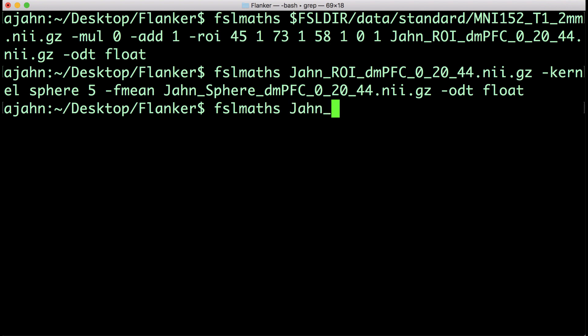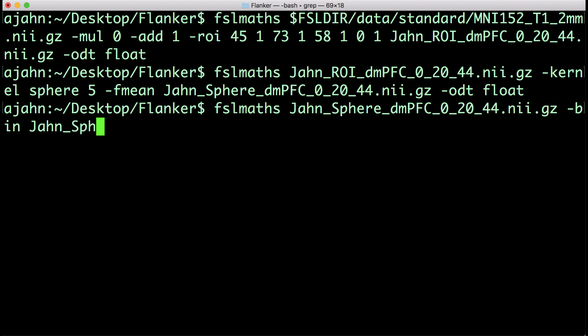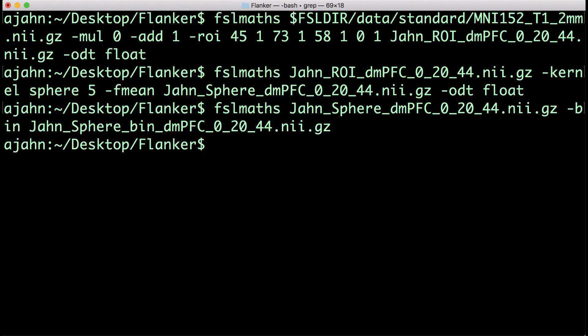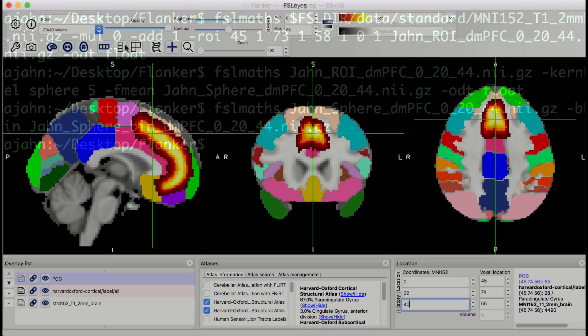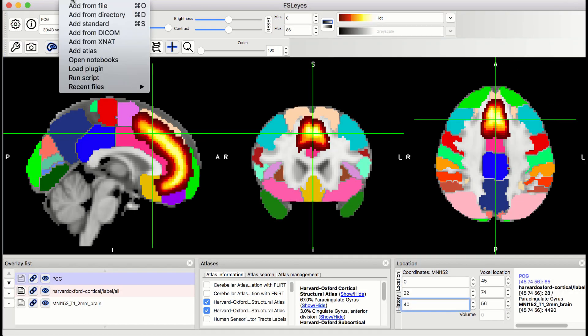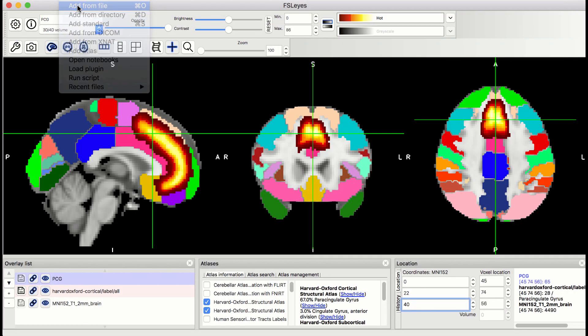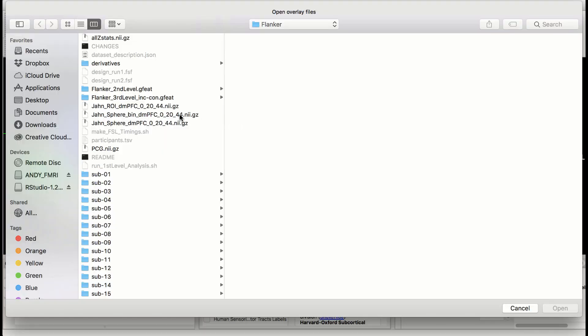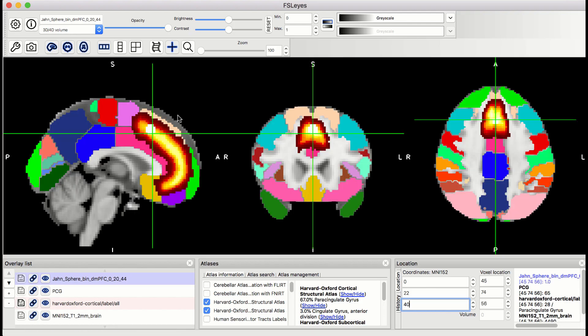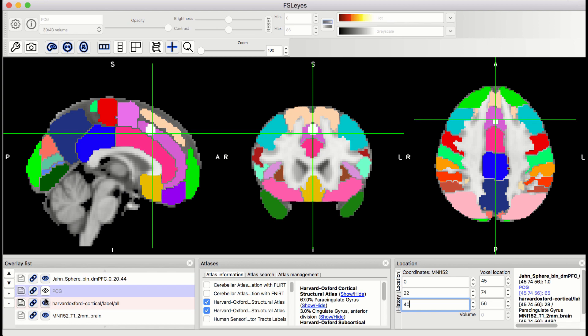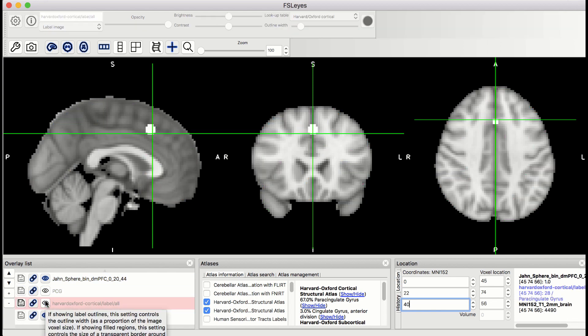Next, type this command, which will binarize the sphere so that it can be read by the FSL commands. This code is all pasted in the More Info box down below for your reference. Load this mask into the FSLView viewer to make sure it is where you think it should be. You can hide the other layers to make it easier to see where the mask is.